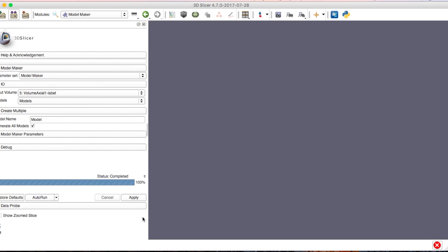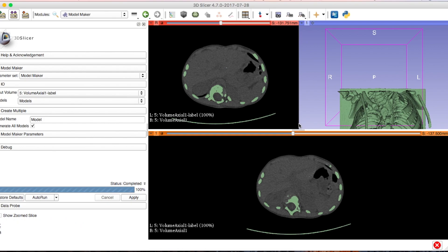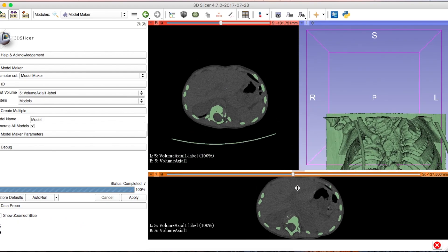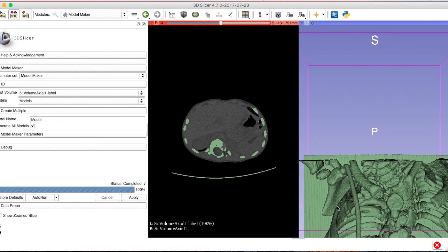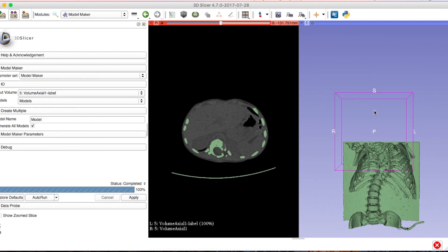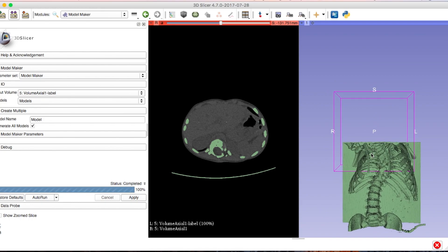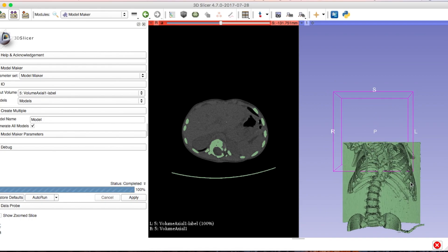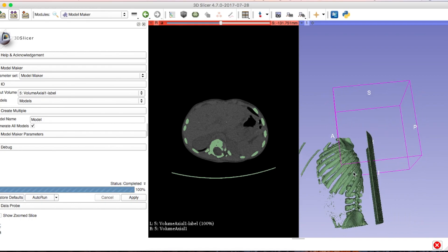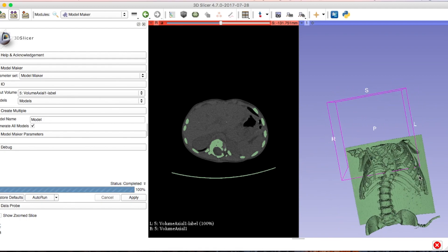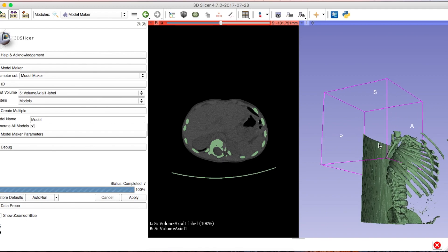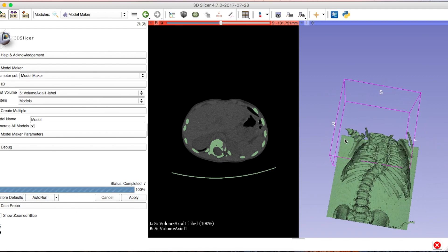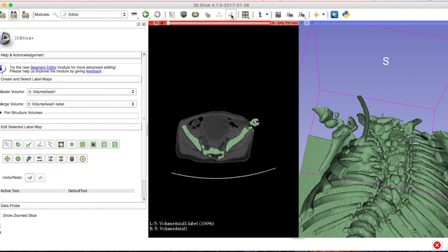There you have your scan on the right, and you can see there is some extraneous matter to clean up — the board in the back, shoulder bones, and arm bones — but for the most part the majority of the scan looks good. This appears to be a complete scan, so we're also going to need to remove the pelvis and some of those vertebrae.